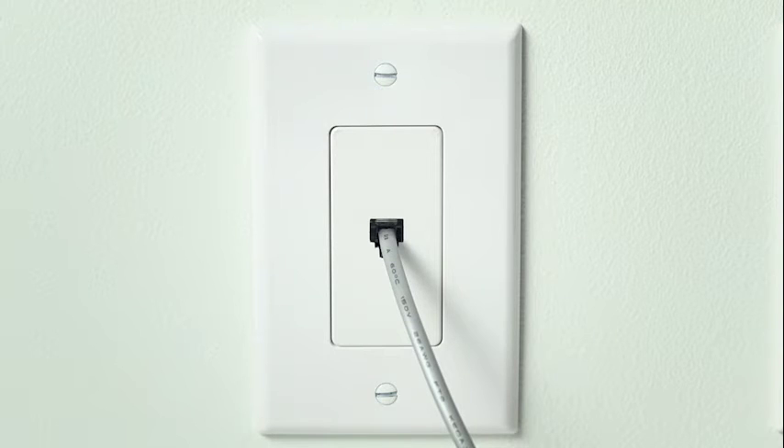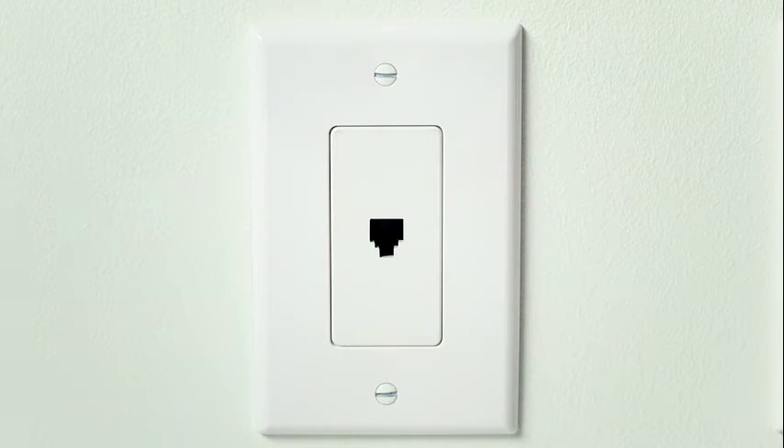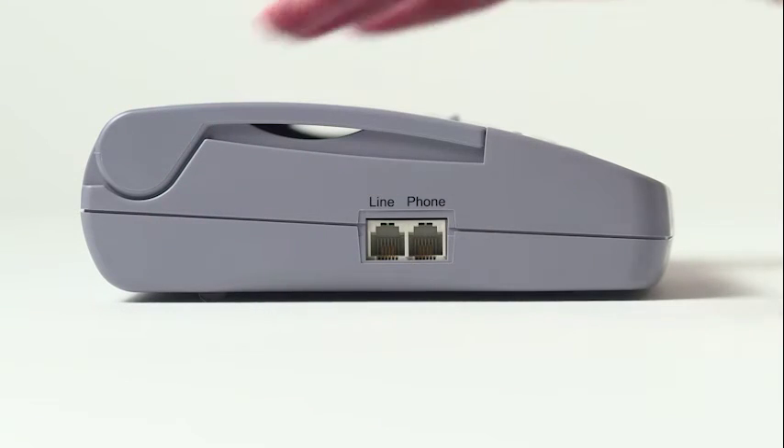Right now, your CareLink monitor is connected to your home's analog phone jack. First, remove the cable from the wall phone jack. Then, remove the other end of the phone cable from your CareLink monitor.